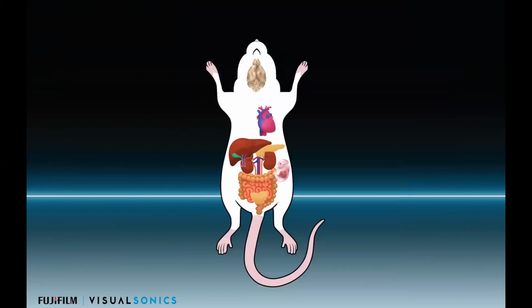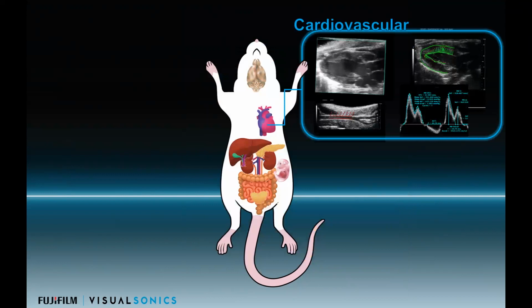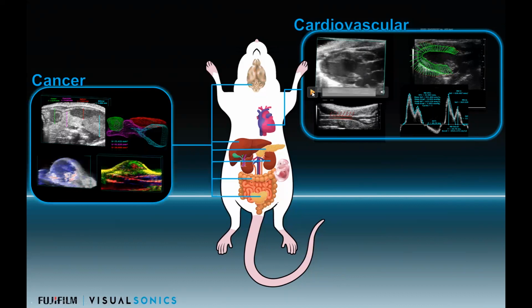Great, thanks, Drew. I just want to go over, again, just to remind people, in case you're only working on one application area, the different application areas we have. There's obviously the cardiovascular part, and Stephen mentioned 4D imaging, for example. There's also strain imaging, being able to measure strain in the myocardium, as well as strain in the vasculature. So that's our vascular strain Vevo Vasc package. Being able to do things like, of course, the usual velocity measurements as well.